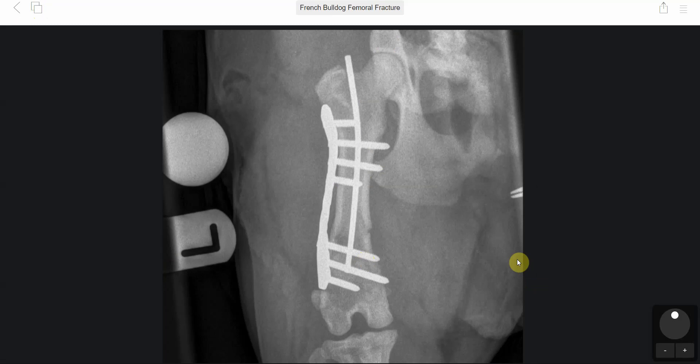On the caudal cranial view, the main thing apparent is the extent of the bending and contouring of the LCP plate — and that's even taken into account as a locking plate. There was still a significant amount of contouring and especially twisting required to ensure the correct spatial alignment of the femur.